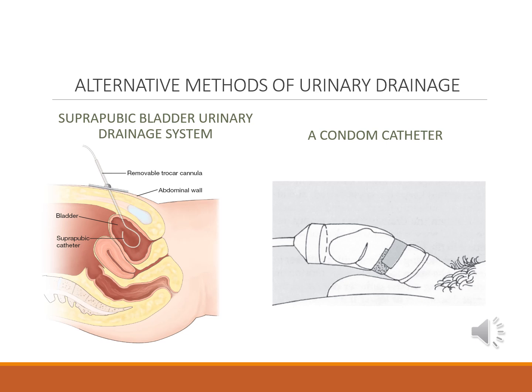The condom catheter is an external device for male patients who are incontinent or have conditions that cause spontaneous bladder emptying. It is a soft rubber sheath secured with an adhesive and connected to the drainage tube as well as the bag. This catheter should be changed every 24 to 48 hours to minimize the risk of UTIs.